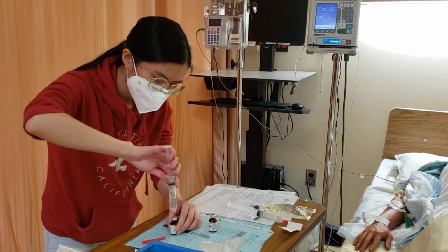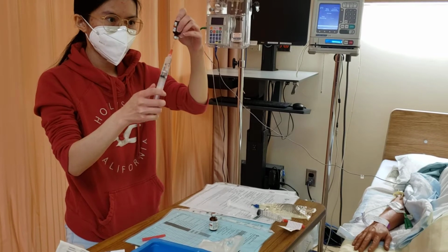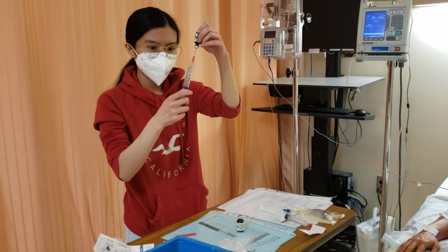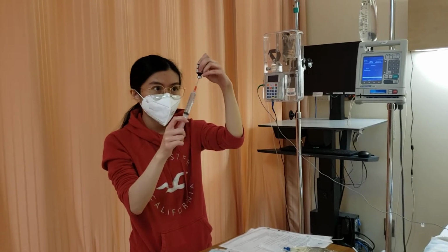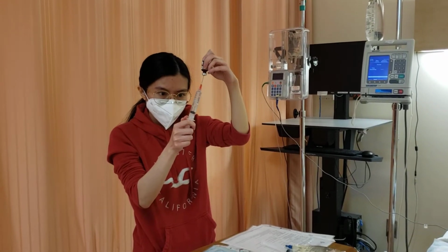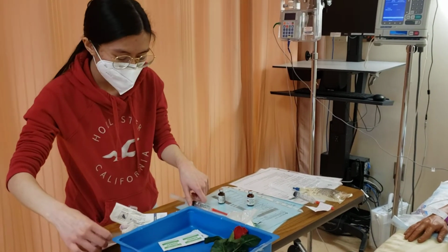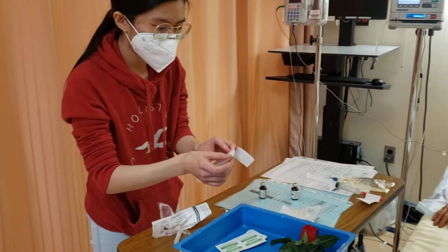Okay, so I will do the second check. Once again, I would need to label that, so that my second nurse will be able to understand what I put in here.